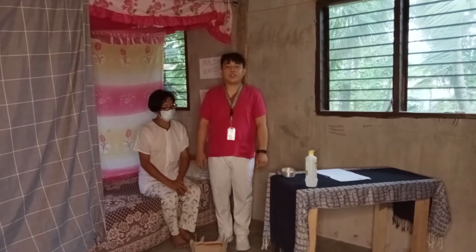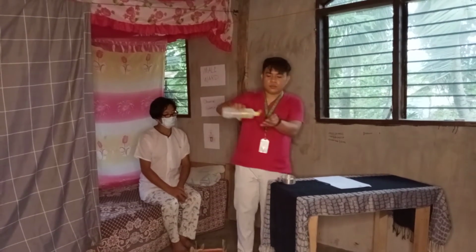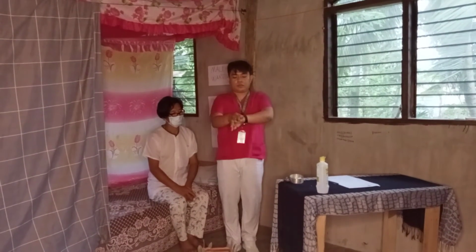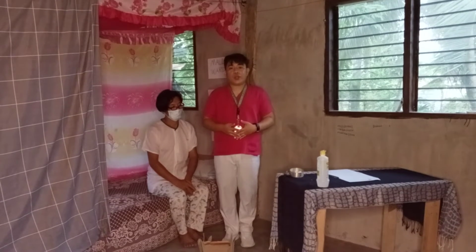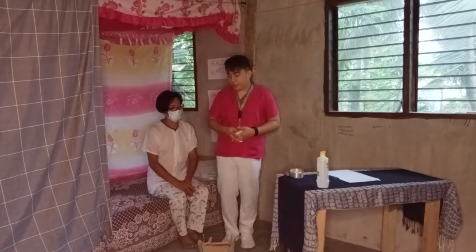Wash hands to reduce the transmission of microorganisms. Draw curtain around the bed and close the door. Rationale: to maintain client privacy and promote comfort.